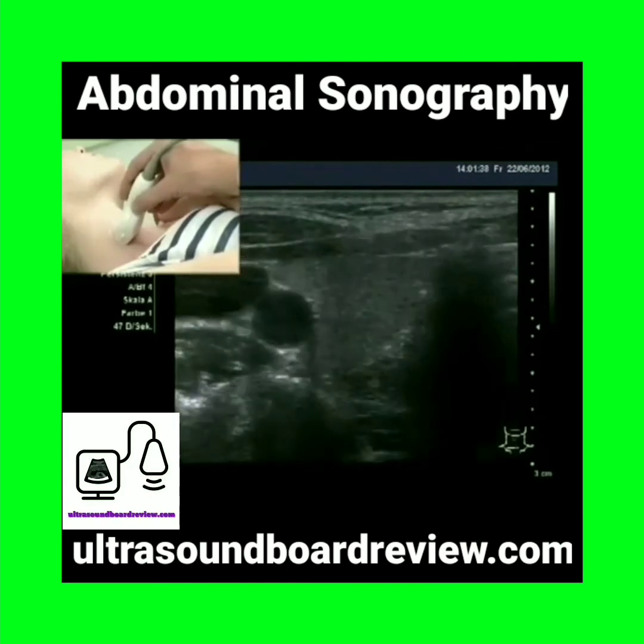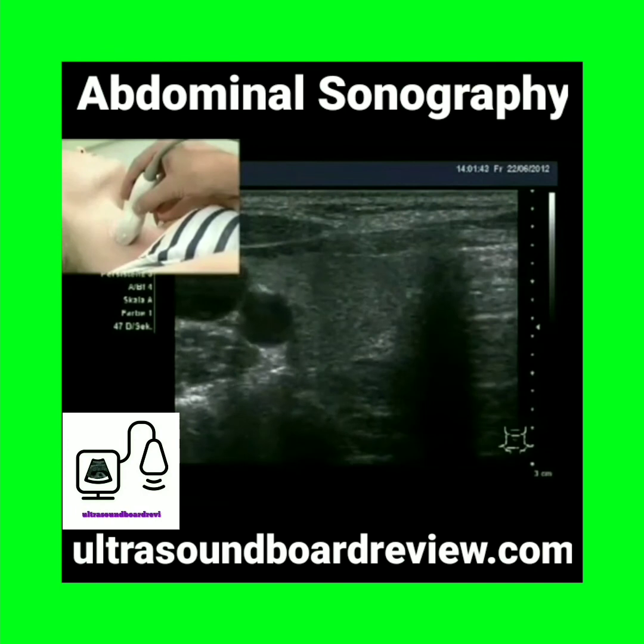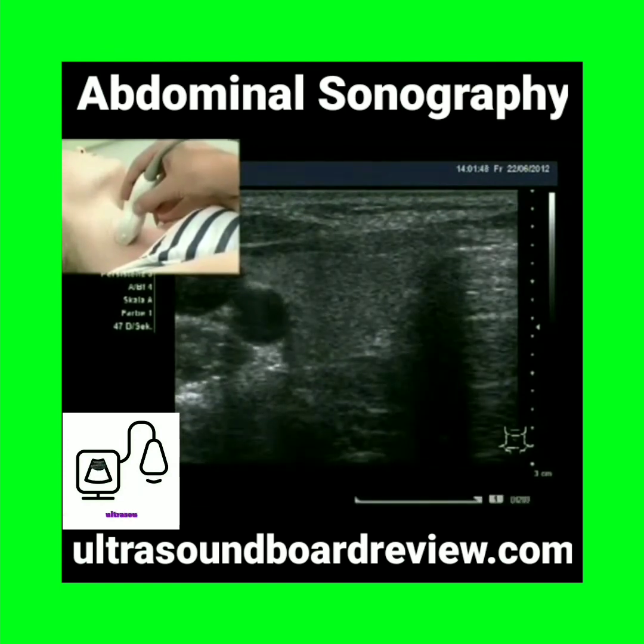Then we change into the transverse view and scan the lobe until we see the largest diameters in transverse section. Freeze the image again and measure the largest diameter from right to left, as well as from anterior to posterior, so that we can calculate the volume of each lobe separately.